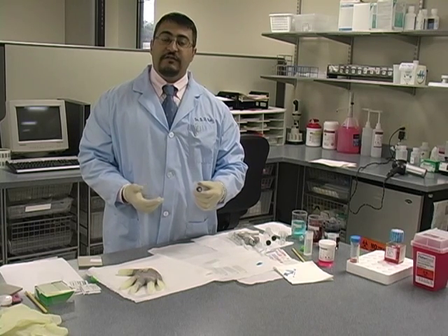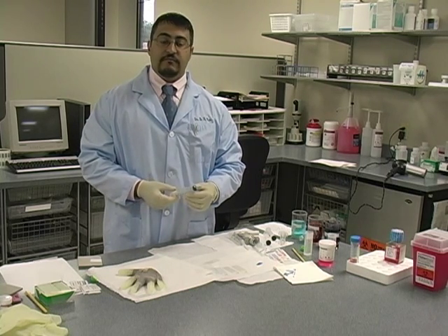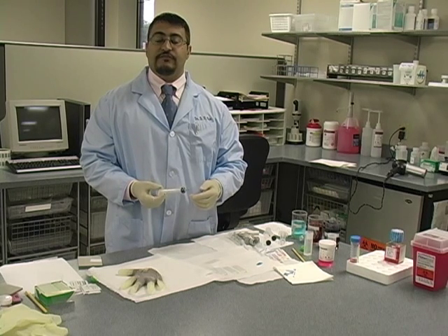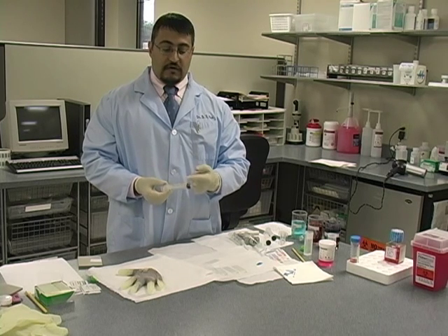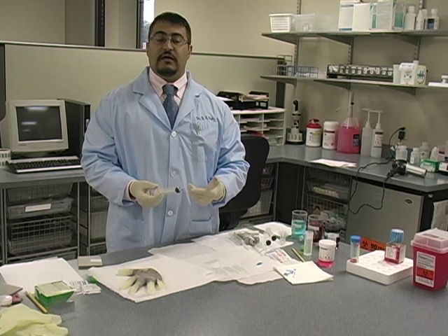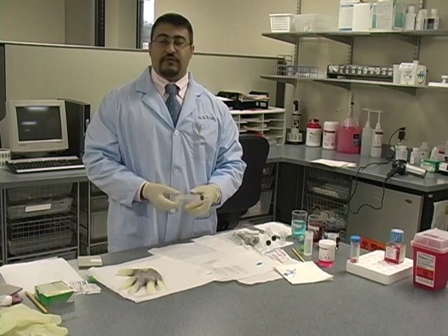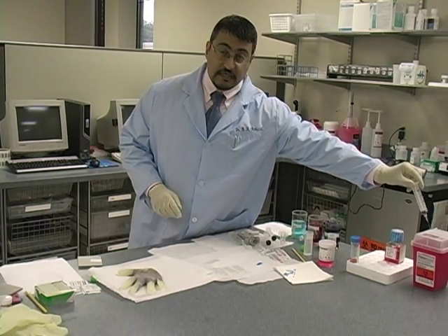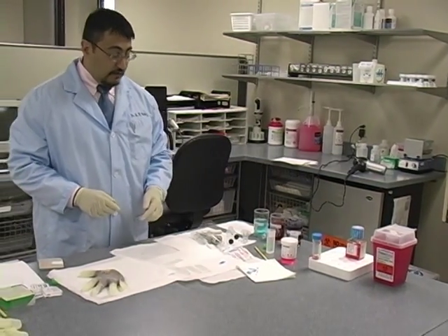Every time I do a pass, I don't reuse the syringe or the needle — even though it's the same patient. It's best to use a new needle and a new syringe with every pass. That way you don't get material clotting up the hub of the needle or into the syringe. You have a nice fresh aspiration needle and syringe with every pass. When we're done, we just put the whole thing in the sharps container and start with a new one.